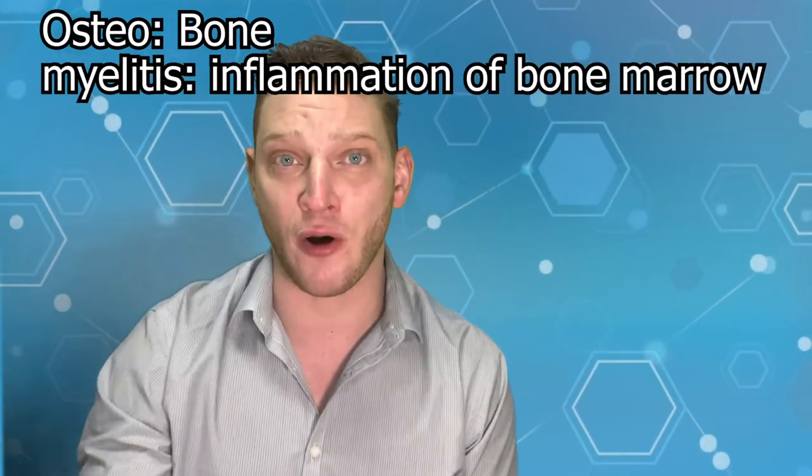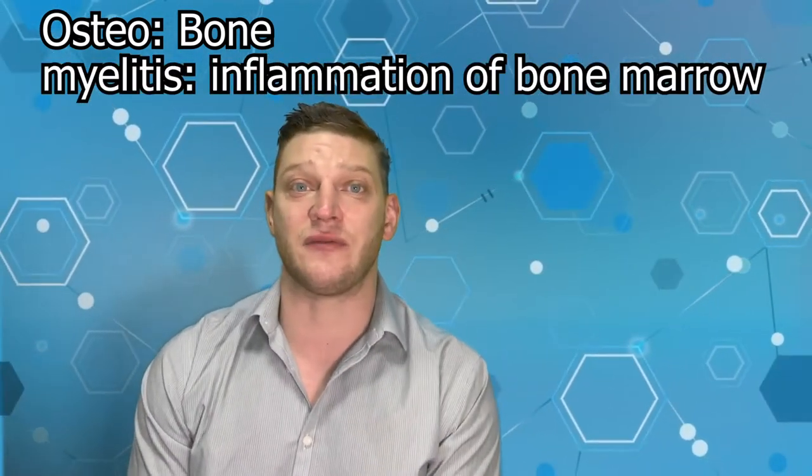He's got a new blood blister and what looks like it could be osteomyelitis. Osteomyelitis — osteo meaning bone, myelitis meaning the inflammation of bone marrow — that is the $5 word for a bone infection. So let's start the video and I'll show you exactly what's going on.